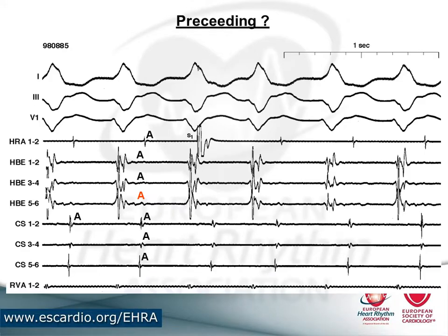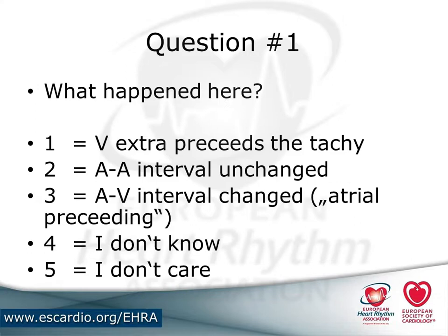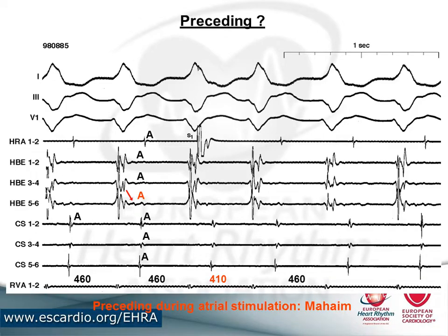Now, during tachycardia, you do the entrainment from the atrial side. A late atrial extra stimulus pulls the ventricular activation in. It's essentially the same way as I showed you for the His synchronicity. You pull the QRS complex forward. Okay, well, I probably gave that away now. I messed up the quiz question, sorry. So what happens here is there is the A, and the A extra stimulus pulls this forward, and then the interval changes. Sorry for mucking that up.